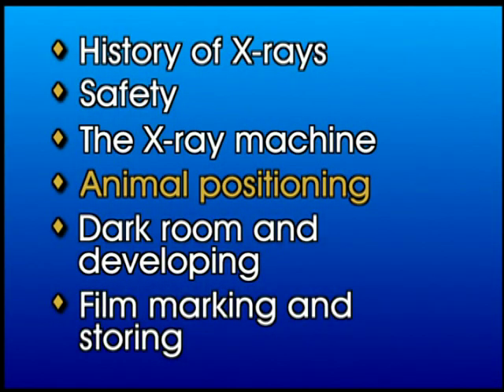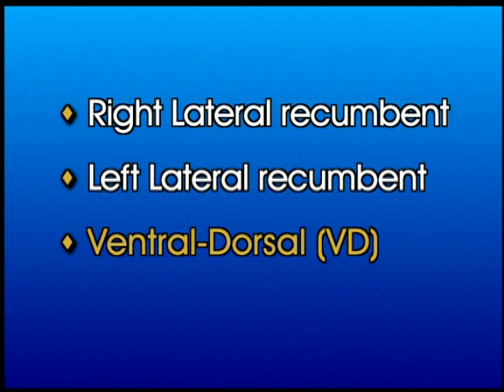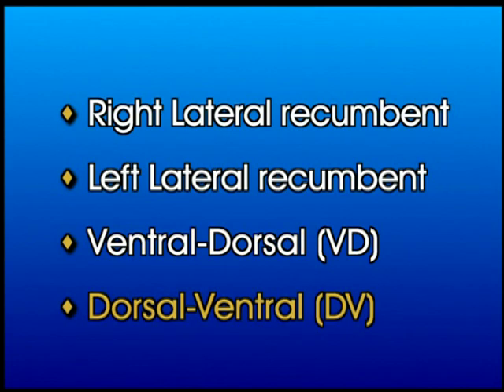We are now ready to consider the various positioning factors of the patient. Various terms are commonly used to describe the position of the animal. You should initially be familiar with the following terms: right and left lateral recumbent views, ventrodorsal views, and dorsoventral views. We will now illustrate each of these positions.